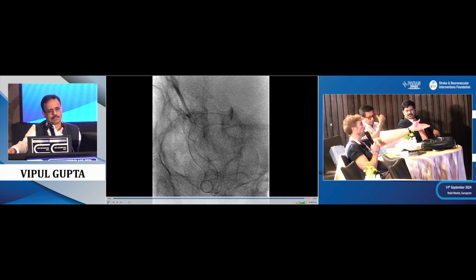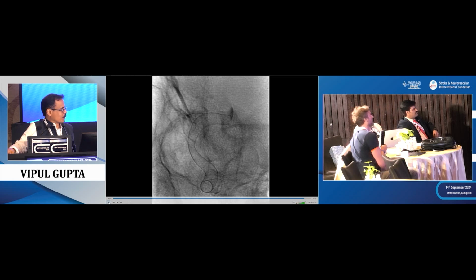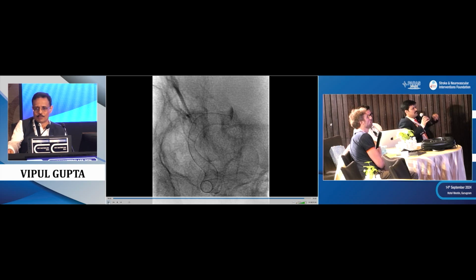You did what you did. Anatomically, it was distal. You tested the collaterality. It was good. So you could. The challenge was with all that heparin, injectable antiplatelets, ticagrelor in the system, making the puncture. So we always do ultrasound guided puncture. Thankfully, my team always have these peripheral IR guys. They're very used to ultrasound guided puncture. You have to make it a very, very careful puncture at that point of time.